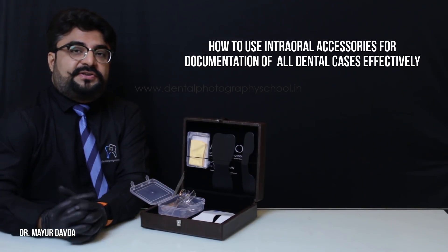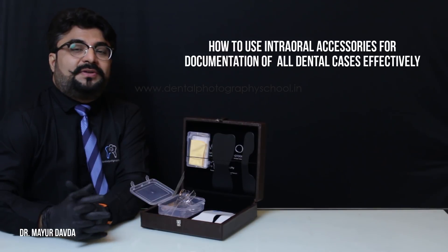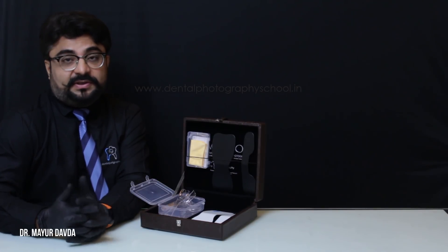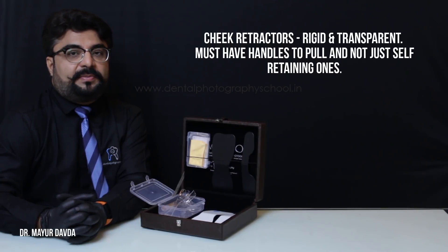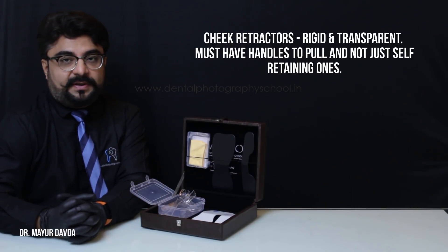First of all, coming to the general criteria as to how to decide what to purchase in your intraoral accessories: generally speaking, the cheek retractors have to be quite rigid as well as transparent — that would be ideal.